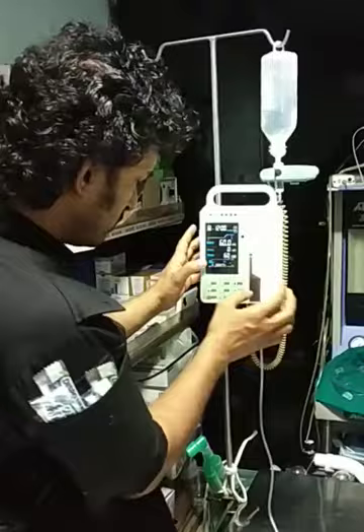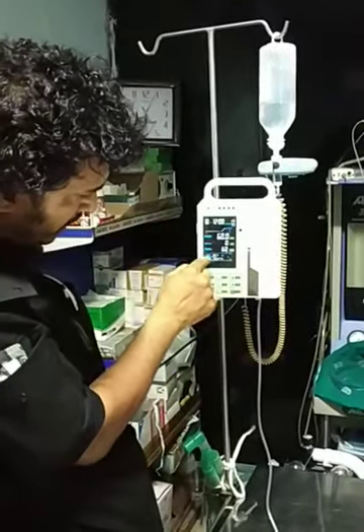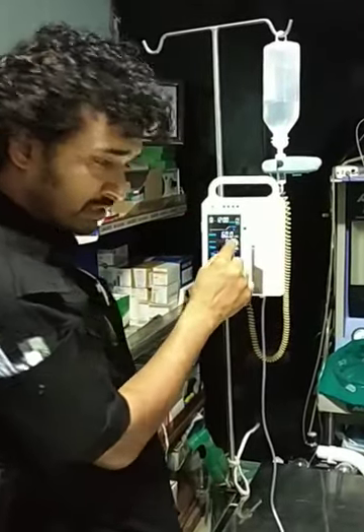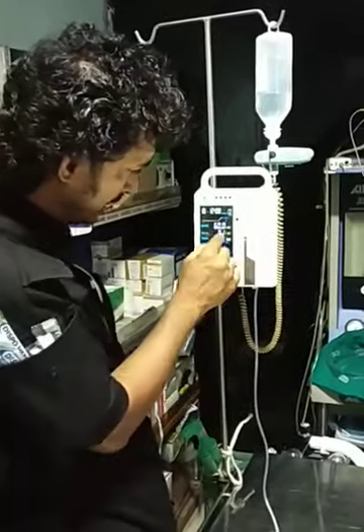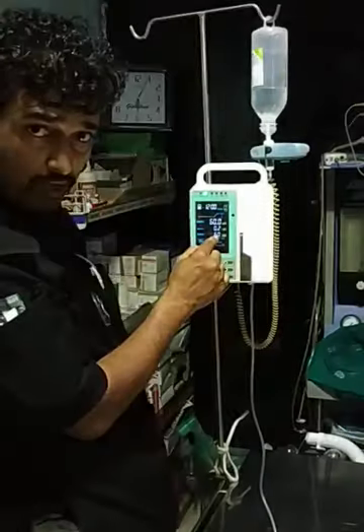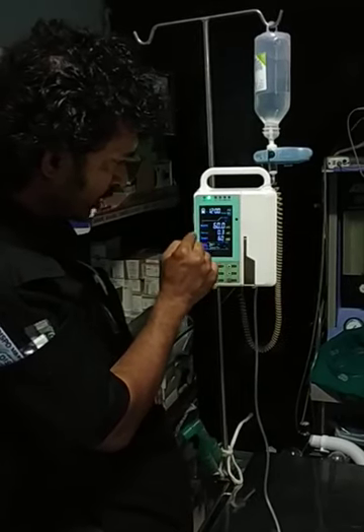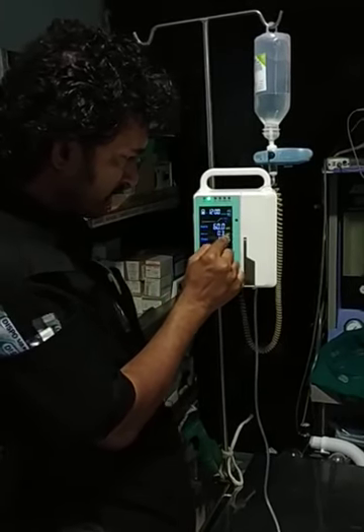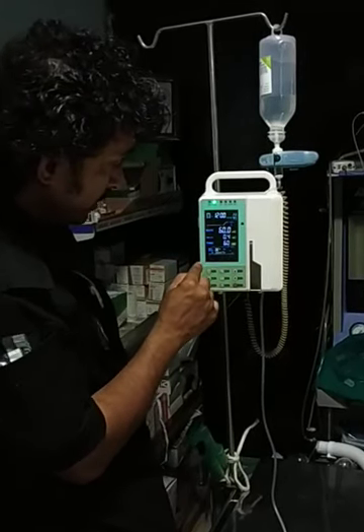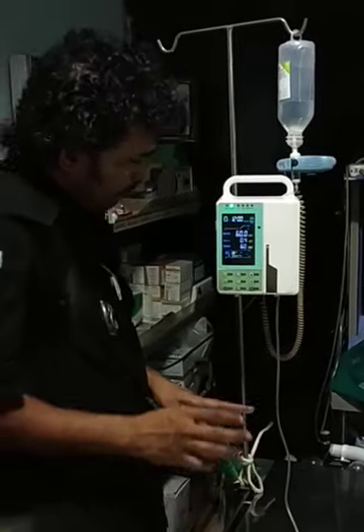Now I am going for the button start. When I start it, I can see the initial temperature which is 25°C, but as the machine runs it will heat up the fluids. This is the amount of ml of fluids that the patient is getting. In a minute you will see that the value of the minute is going to get reduced. I know exactly the rate at which the fluids are going, how much fluid the animal has received, and the temperature — which has now come to 37°C, which is great. I know exactly how many drops are being given.